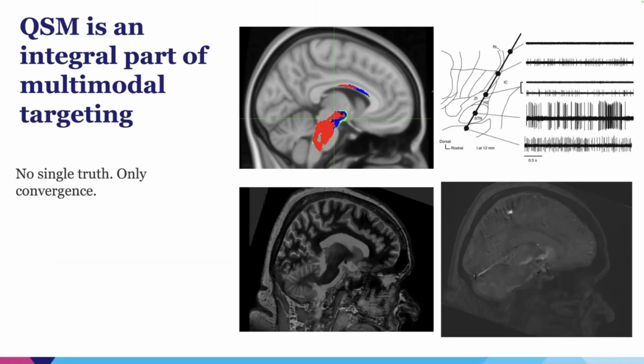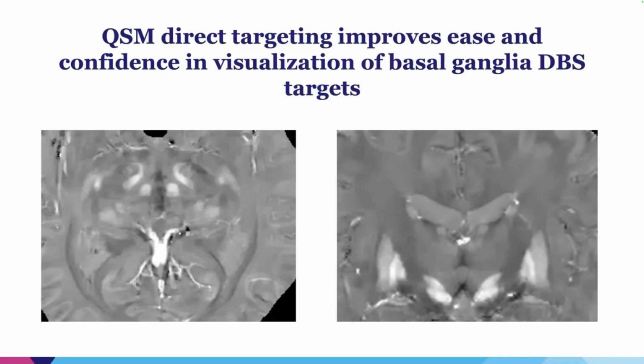There's no one single best sequence, but it's certainly a part of a multimodal imaging strategy that I think yields the best results and yields the most consistent results, which is what we want as surgeons. And it certainly improves the ease and confidence and visualization of the basal ganglia, DBS targets, and focused ultrasound targets.